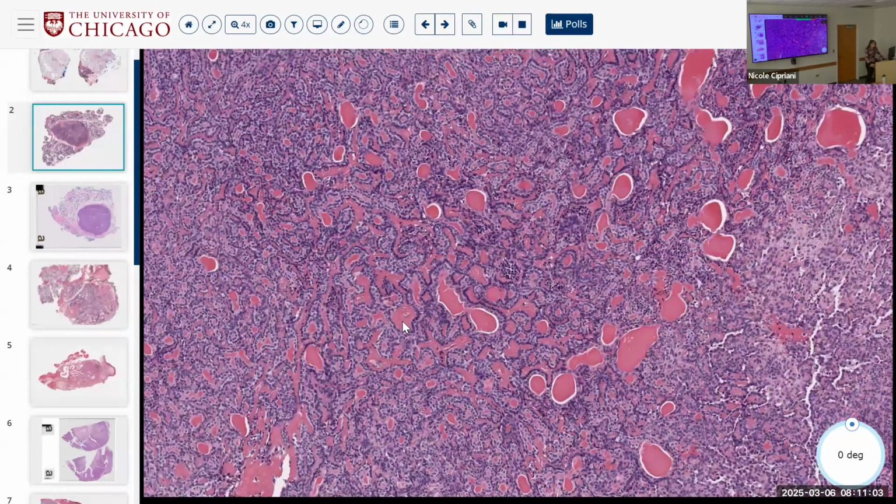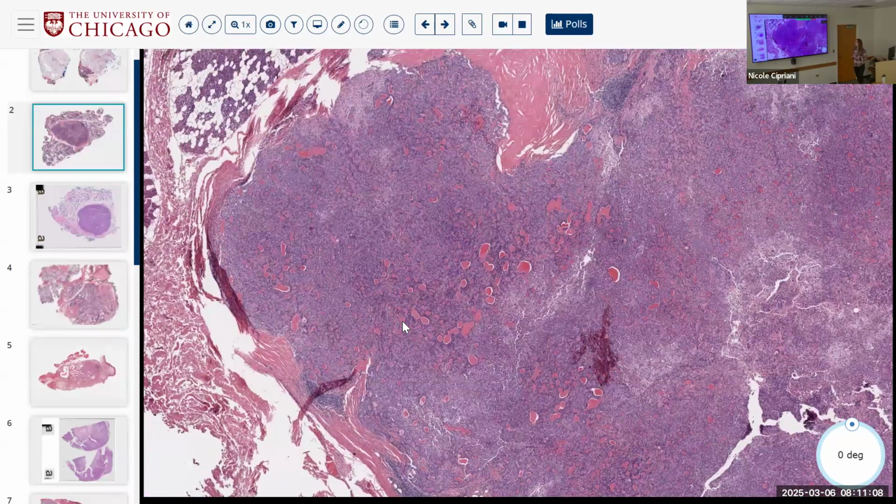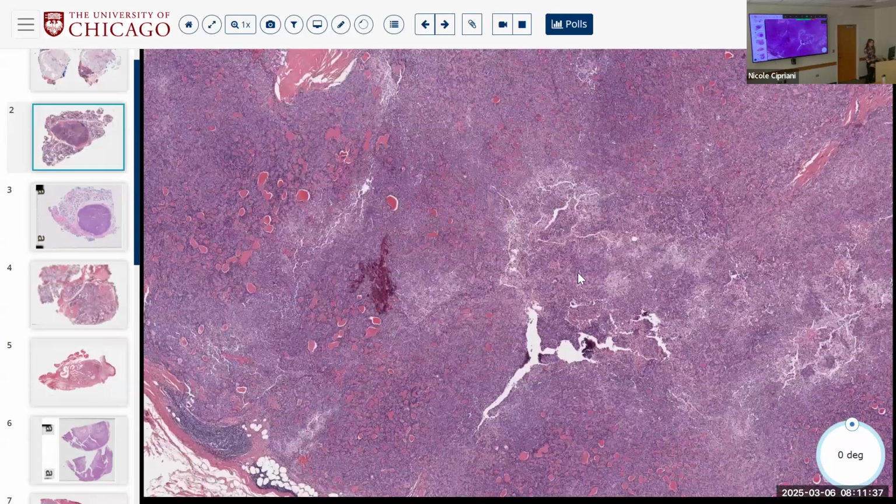So I think your differential diagnosis of a cellular pleomorphic adenoma versus a possible basal cell adenoma is a good one. And there are a few things that, if you had genetics, may help you sort things out, but you usually don't on salivary neoplasms unless you order it yourself. And it may not matter, because if you're going from one benign thing to another benign thing, it's a benign thing, right? So the bottom line is we agree that this is either benign or low grade. It's biphasic, and it has some stromal material.